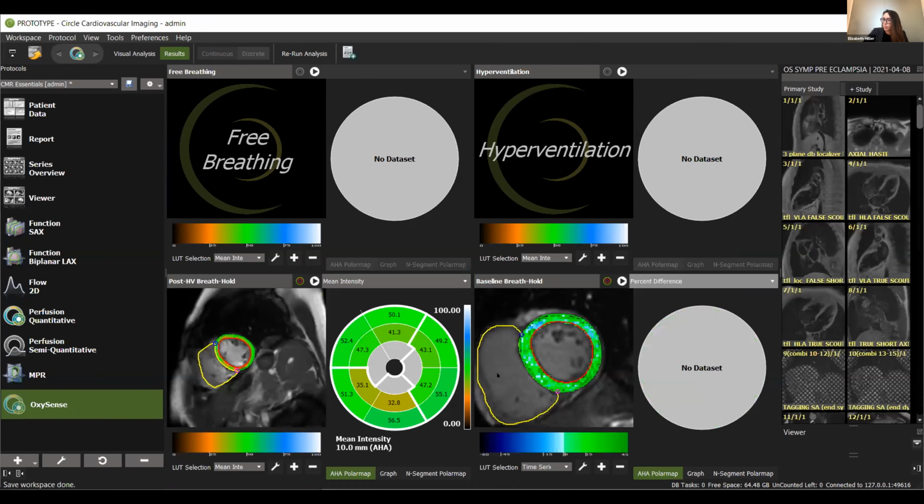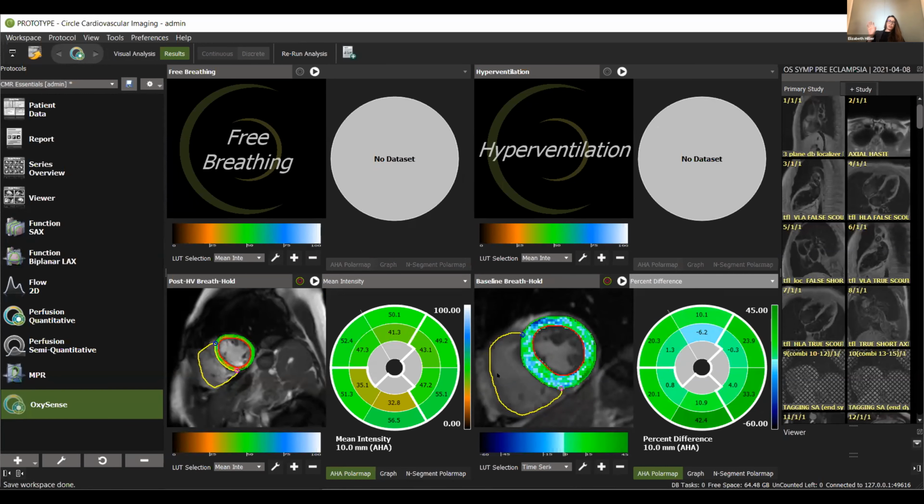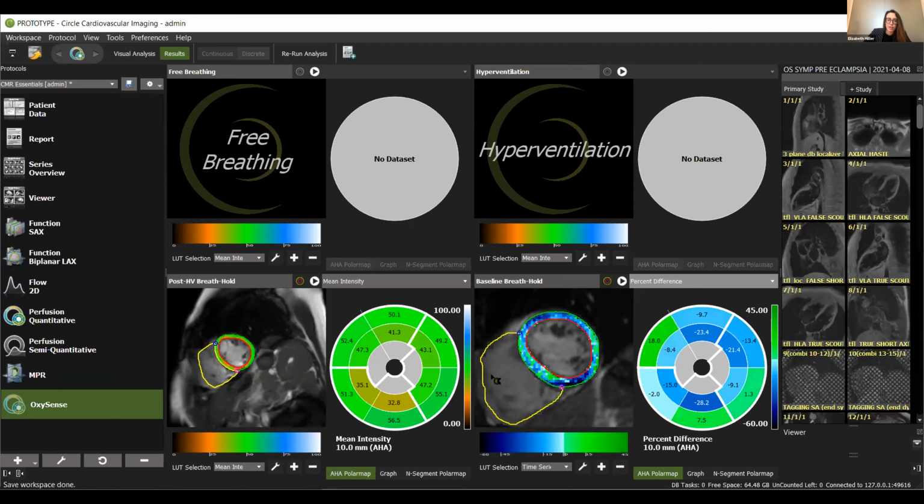And what we can see here and what we found in the preliminary analysis of this study with Dr. Quesada is that we are seeing in some ways some similar features to our ANOCA patients that we published the research letter on. So we see some areas of heterogeneity here, and I think this mid-slice particularly really highlights this quite well. Anything that's blue, as we mentioned before, any pixel that's blue is below our previously established cutoff values for being not fully healthy myocardium. And so we can see that here, and again, we can scroll through the entire cardiac cycle to really fully appreciate this across time, across pressures, across all states of the cardiac cycle.